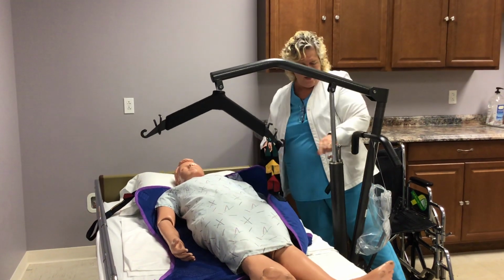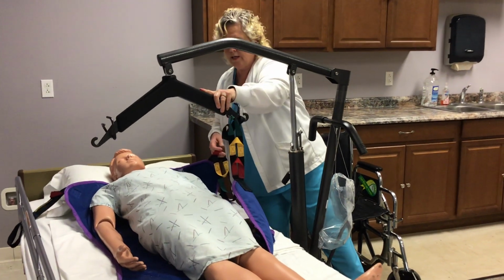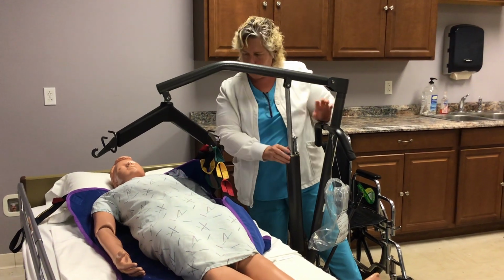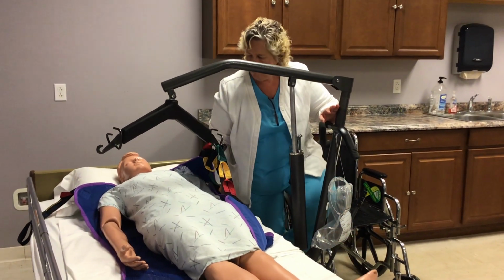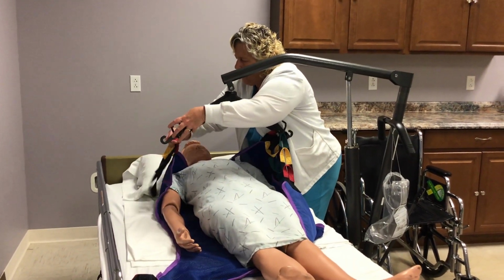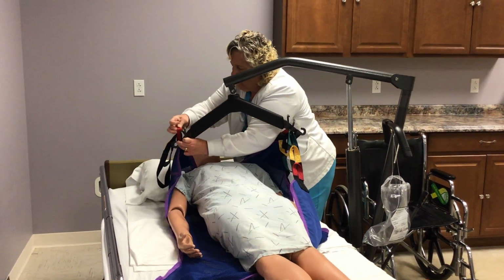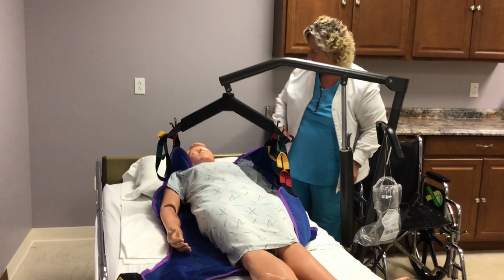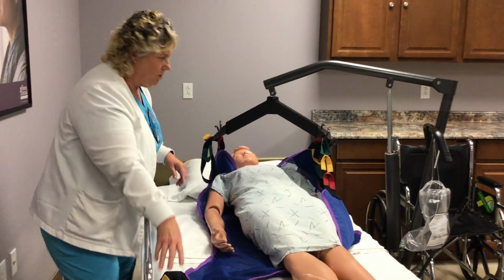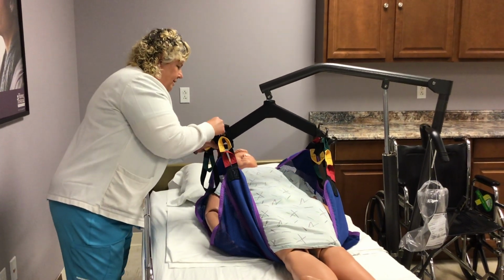Let me get it over here. This little nozzle right here, or knob, will lower it, keep it lower, and you can also just kind of bring it towards you too, to have some slack there. Now I'm also going to do this side, so I'm going to use the red on this side, and you may have to do some little adjusting and pulling here. And then if you can go around to the other side, or you can do it from that side. I'm going to show you both ways. And then if I use green on that side, I'm going to use green on this side.